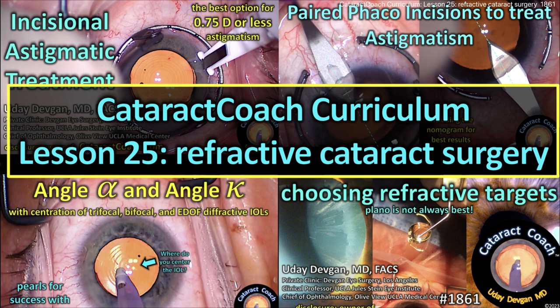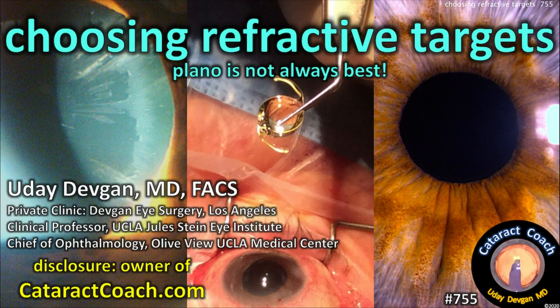CataractCoach.com, curriculum lesson number 25: refractive cataract surgery, the final video in our curriculum series. Choosing refractive targets — plano is not always best. Disclosure: I publish CataractCoach.com, a free teaching website.